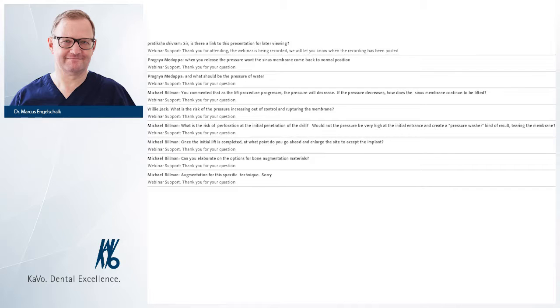The pressure is not the problem, because we have a pressure on a very short period of time. We have an oscillating liquid, and we have just a small amount of liquid coming in. It's not 5.0 milliliters at one time. This is very important to know.